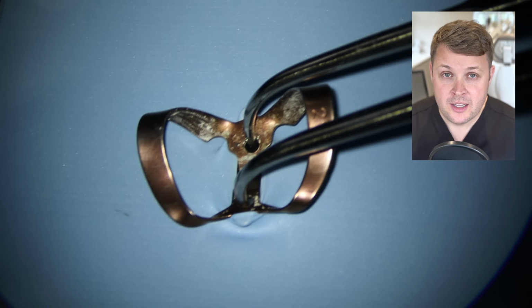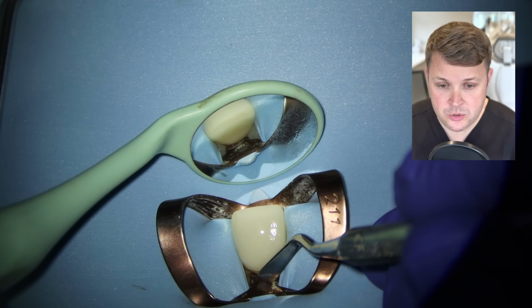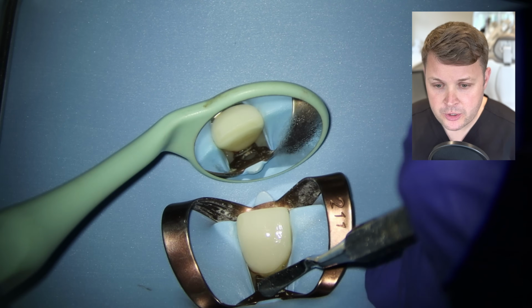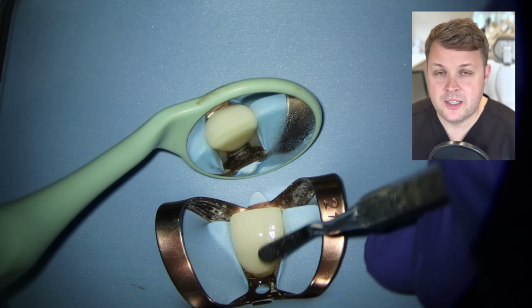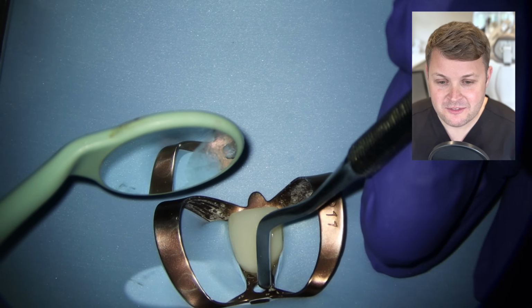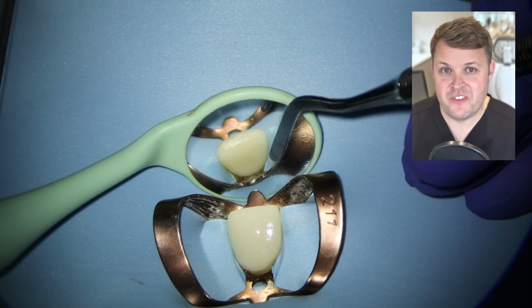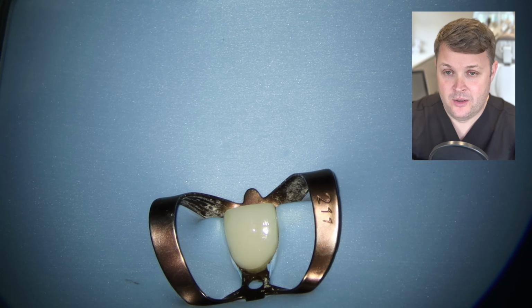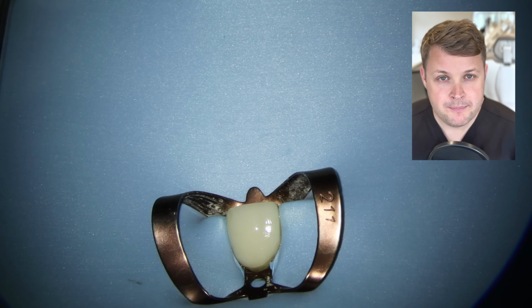here and thinking to ourselves, well, we're going to access this tooth, we're going to go through the crown, we've lost all of its anatomical landmarks, so we don't want to perforate the tooth, and I'm placing the rubber dam on now. I used to access the tooth first, but I'm seeing now that really the rubber dam moves the gingiva out of the way, and actually we can see where the CEJs, we can see where the root is a little bit more clearly in most cases.